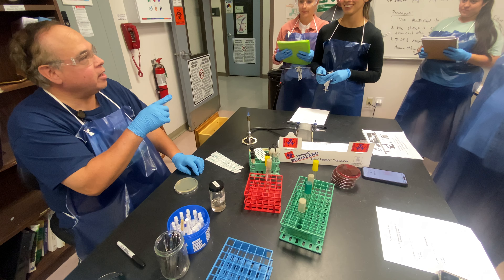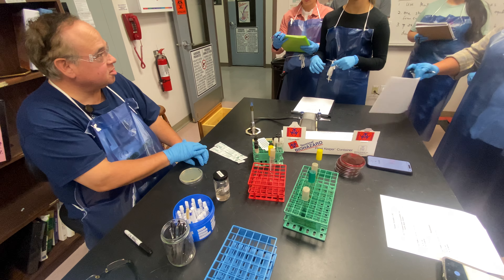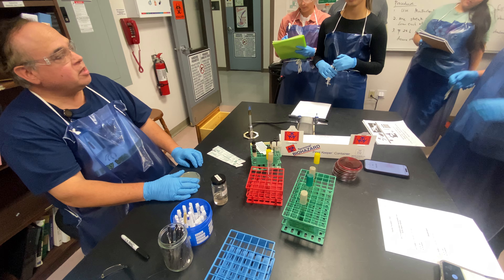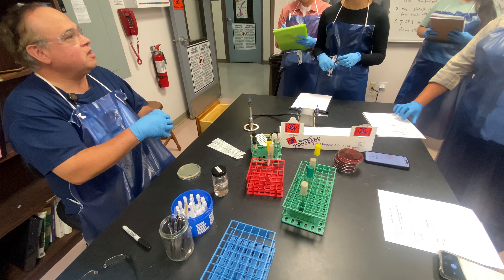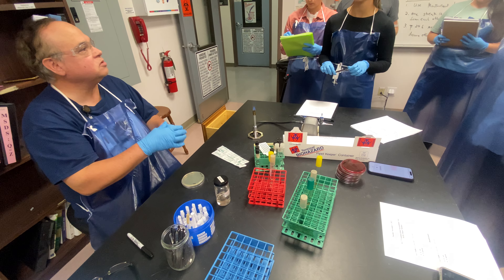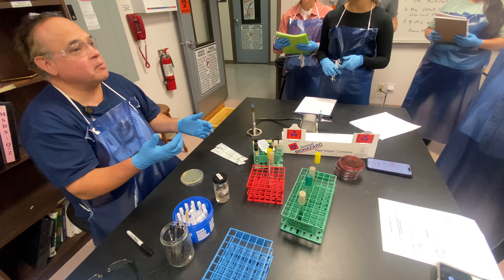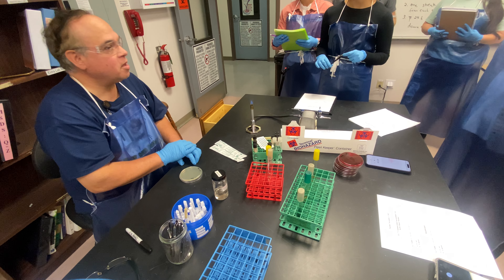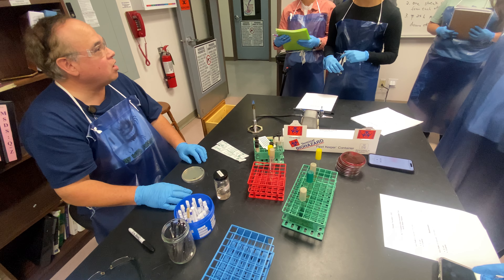Today we're going to be doing antimicrobial susceptibility testing, also sometimes referred to as antibiotic sensitivity testing — it's all the same. If we think about a big hospital, they're going to have all this stuff that's automatic. They have big instruments that they put the organisms in, put it in a cart, the cart goes into an incubator, the incubator is read by a computer, and then the computer spits out the probability of the organism being sensitive or resistant. Smaller outfits don't have that, so I'm going to teach you the clinical way to do what we call a Kirby-Bauer.